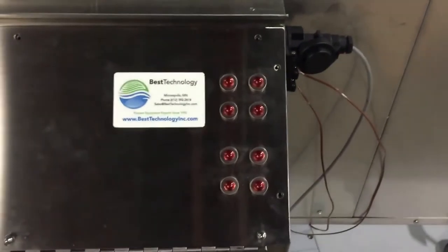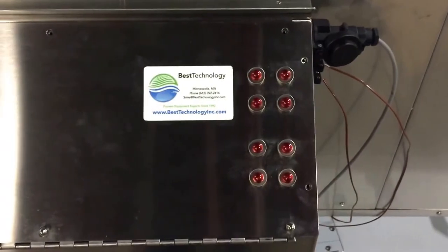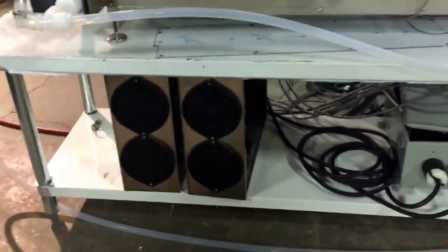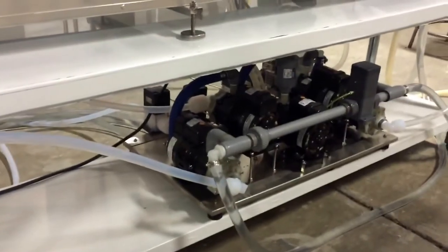All ultrasonic boards are monitored to ensure board output is always on during use, so there is no variation in process. The ultrasonic generators are located down here, along with the NEMA power box and pump manifold for the drains.